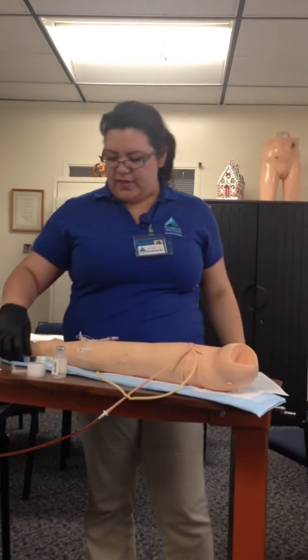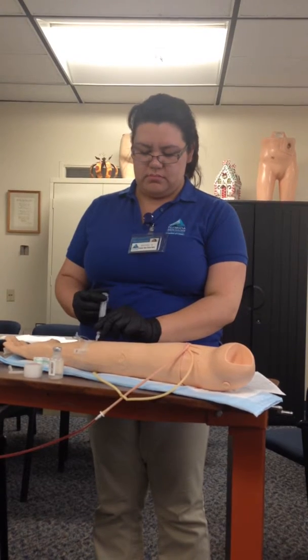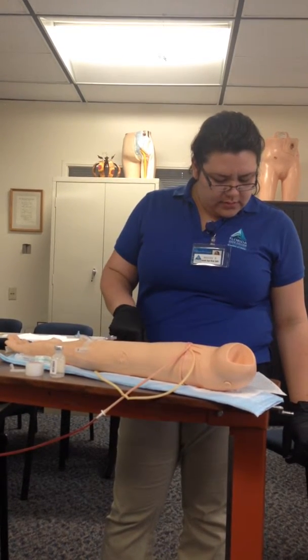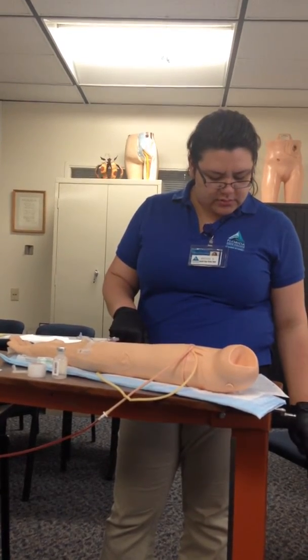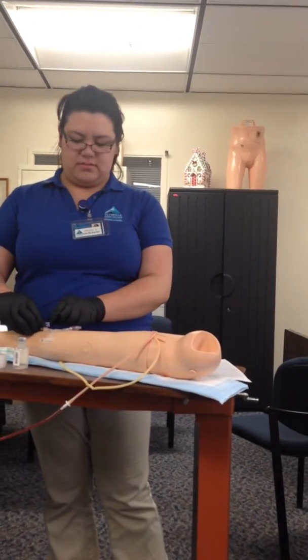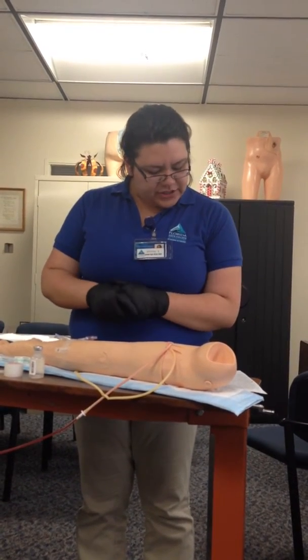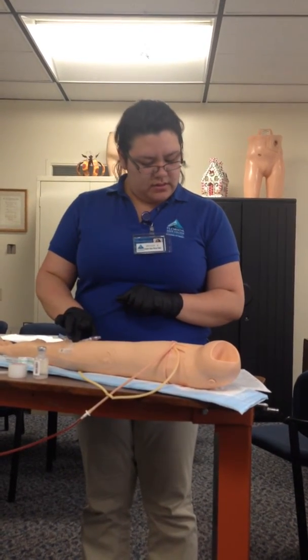And I'm going to flush my other 3 mLs in the line using the push-stop method. Clamp simultaneously as you withdraw the syringe. No, I'm supposed to clamp. I was supposed to clamp. And then the H of ASASH is only used when heparin is used to flush a central line or a PICC line.